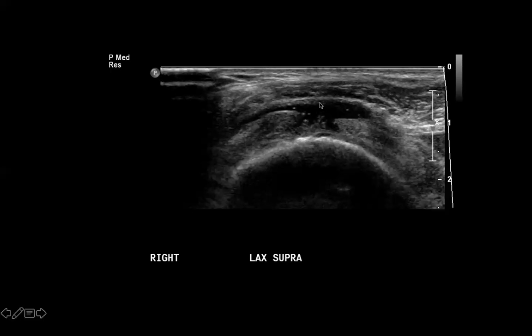Notice that the supraspinatus tendon has a complete defect because we have some tendon fibers here and some here, with a large anechoic defect in the tendon. In fact, these tendon fibers have been retracted. The tear of the supraspinatus involves the entire thickness of the tendon because it goes all the way from the articular surface at the humeral head all the way to the bursal surface. This is in fact a full thickness rotator cuff tear.